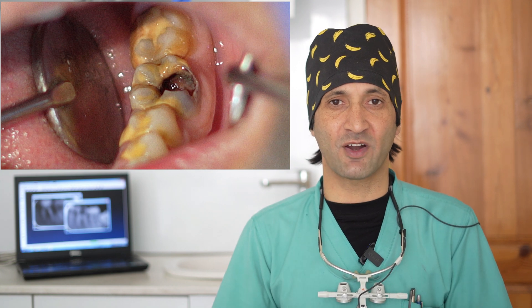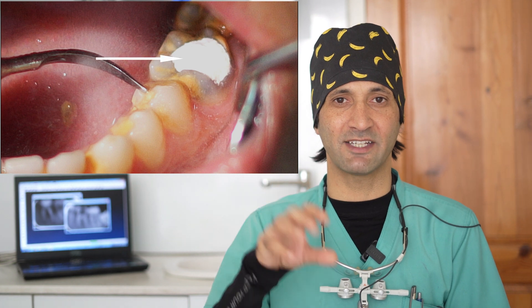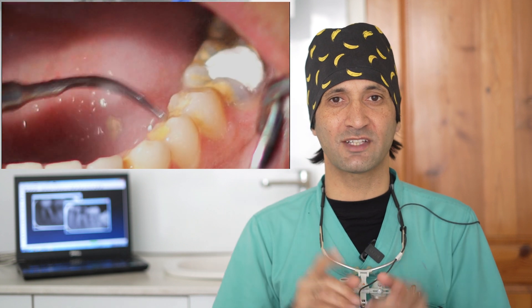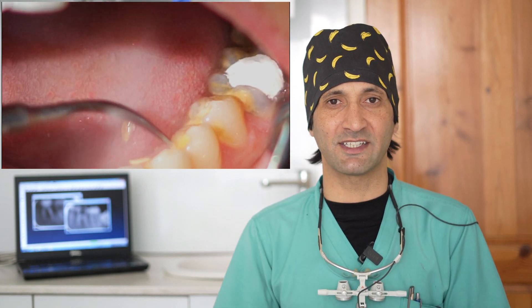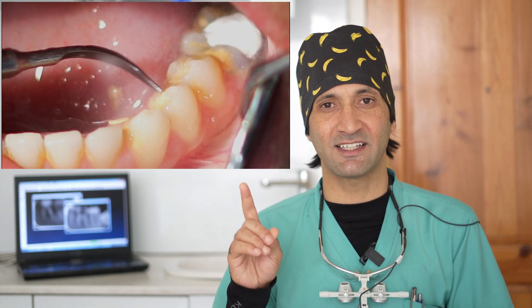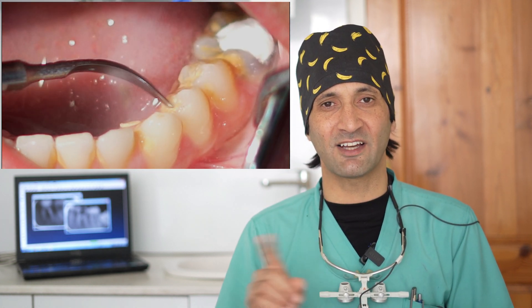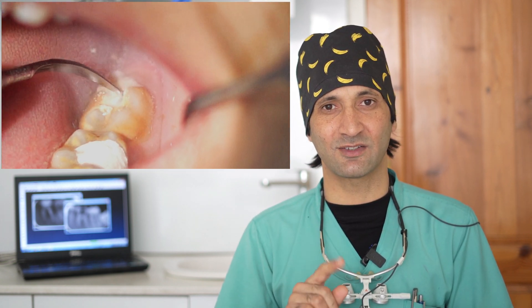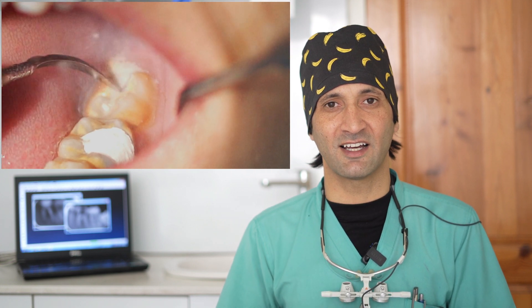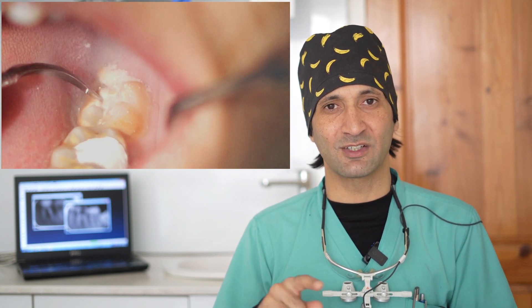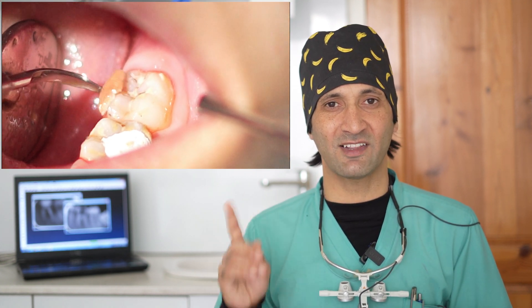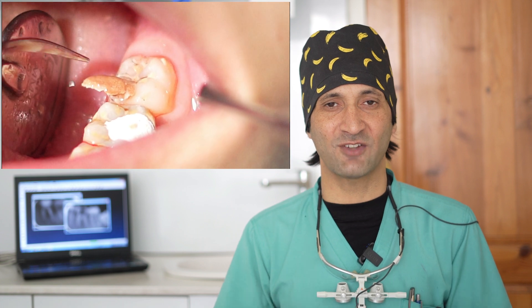Everywhere you can see there is a huge buildup of calculus on the surrounding teeth, which needs to be removed before starting root canal treatment. So first, I placed a temporary filling over the cavity so that I could clean all the area — removing calculus from the adjacent teeth to reduce the microbial load. You can see here that the cavity is temporarily filled, and then I started cleaning the adjacent teeth, first on the premolar side, and then moving to the molars.